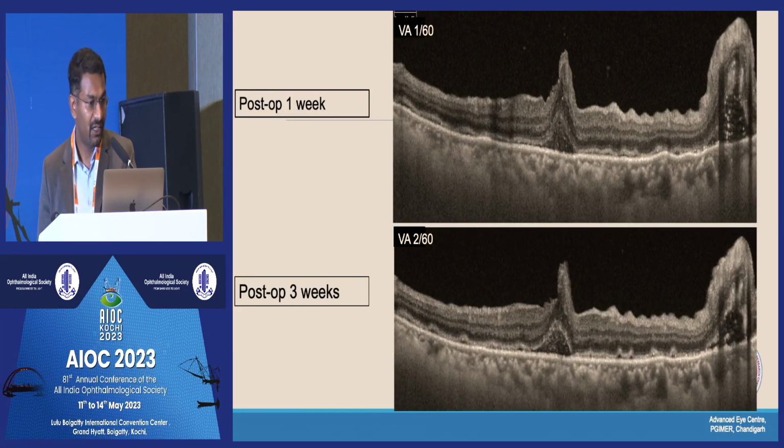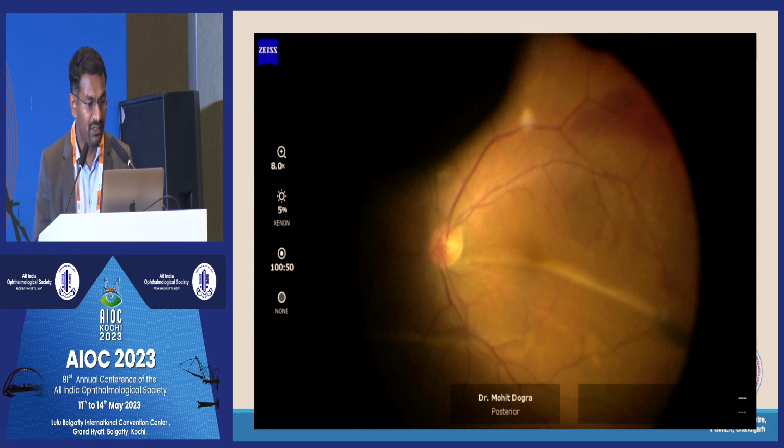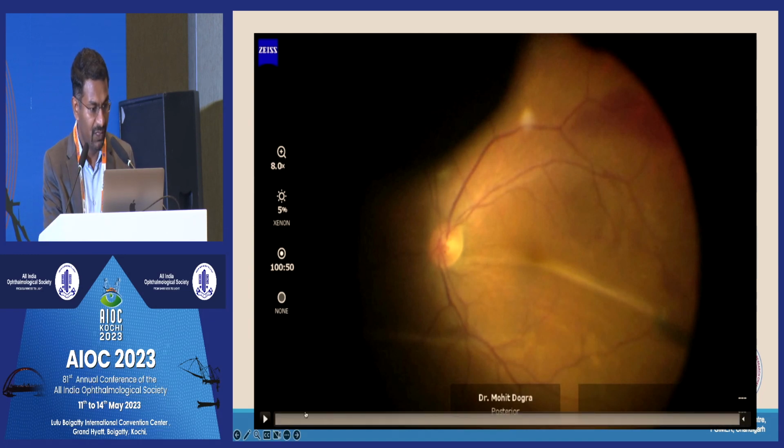We waited for about 4 weeks, but the full thickness retinal fold didn't resolve on its own. Hence we took her for surgery. In this surgical video, I'm going to show you.